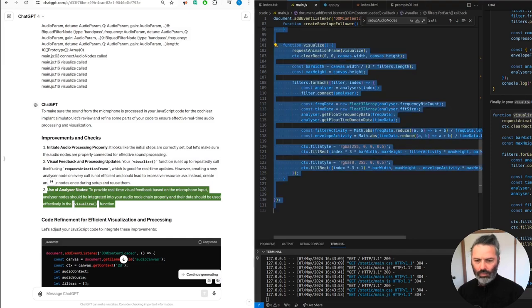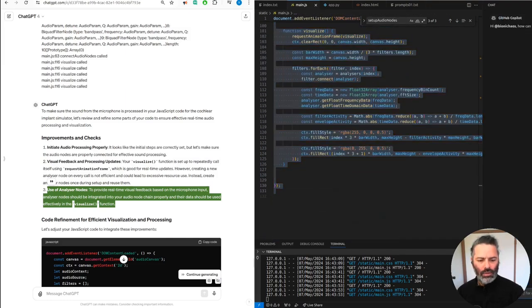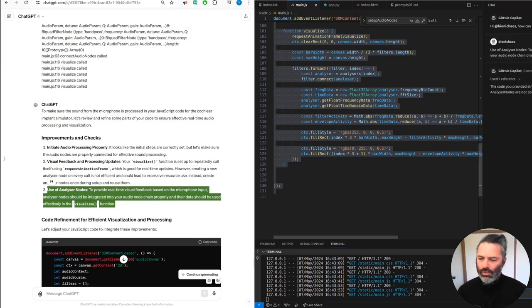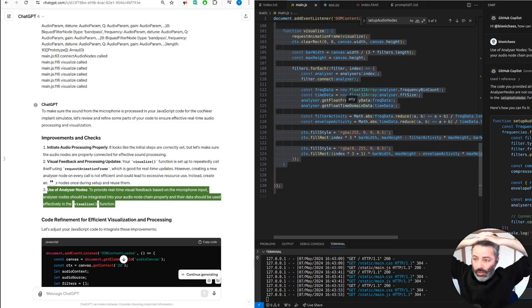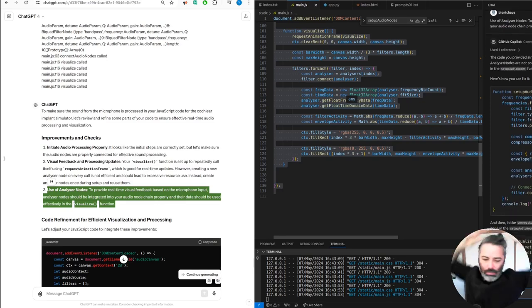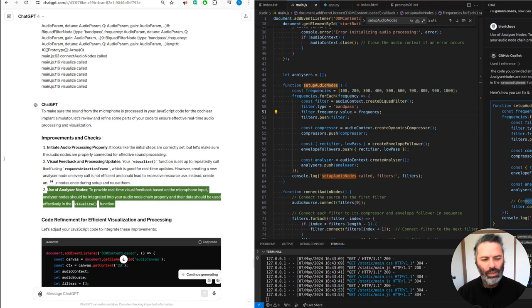To provide real-time visual feedback based on the microphone input, analyzer nodes should be integrated into your audio node chain properly and the data should be used effectively in the visualize function. Fix that node chain microphone input. Yeah, don't think we're using the microphone input. It's unbelievable that most of the time is just spent on these little tiny bits and bobs. Don't like it. Connect the filter.